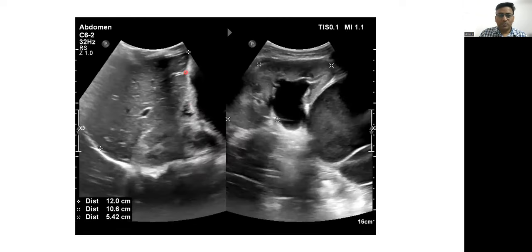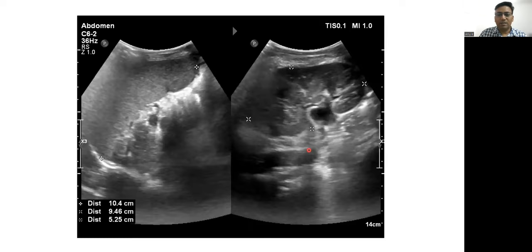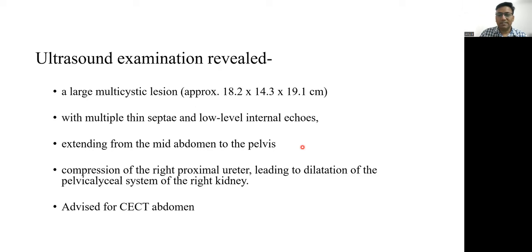The liver appears normal in size and echo texture. The right kidney shows hydronephrosis because this cyst causes mass effect and compression of the right proximal ureter, causing upstream hydronephrosis. The spleen is normal in size and echo texture. The left kidney is normal in size with maintained corticomedullary differentiation and no pelvicalyceal system dilatation. Apart from these visceral organs, we are not able to appreciate the pancreas or bowel, as this cystic mass is occupying almost the whole abdomen.